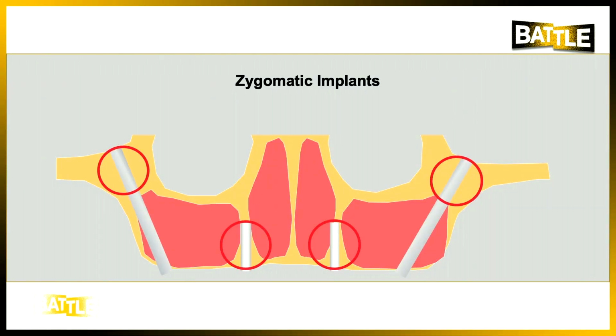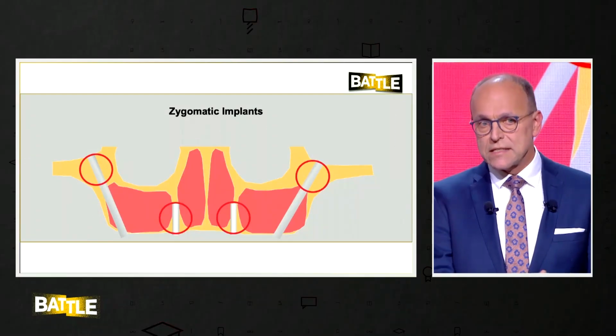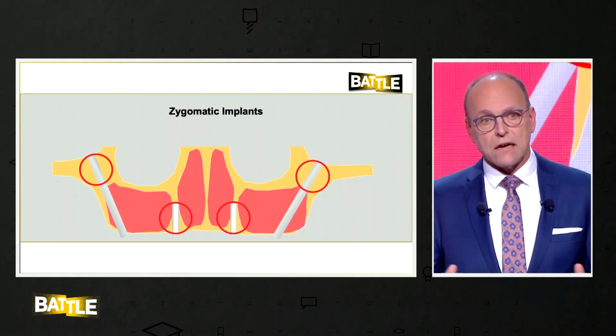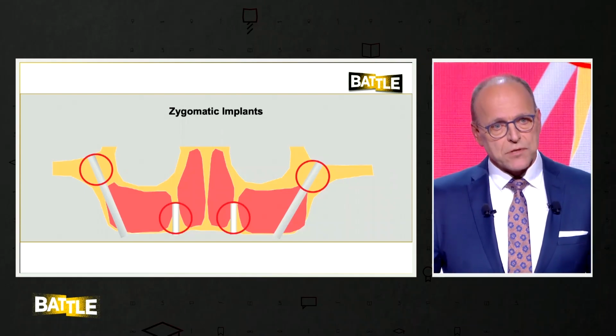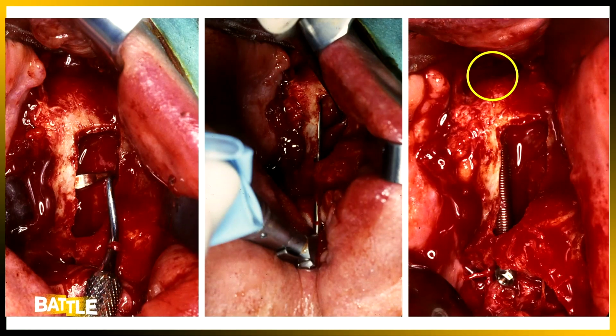Now an alternative approach departs from the reconstruction of the alveolar crest and simply uses what is there, saying forget about augmentation, use the bone that is there. This is the zygomatic area that is very stable even in resorbed ridges, and the remnants of the maxillary bone between the nasal cavity and the sinus cavities. But the procedures you need to place these implants are everything other than minimally invasive. You need a bilateral sinus lift, you need large burrs to place these implants, you need an extensive dissection of the zygoma.